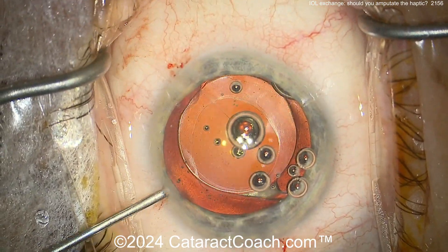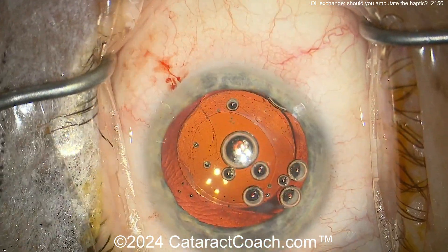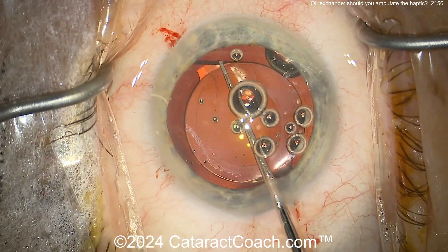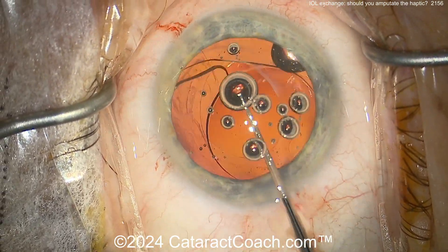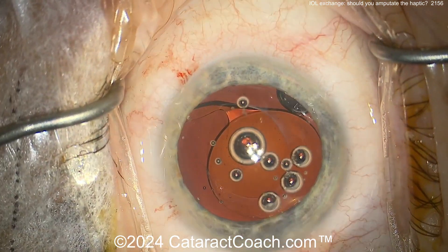So you want to spend your time really just dissecting this out. I've got good videos on CataractCoach.com that explain how to really separate it. But sometimes you just can't. You can see it's still attached — that haptic looks free except the tip. The tip of it is stuck to the capsule there. We don't want to break the capsule; we don't want to cause zonulopathy here.